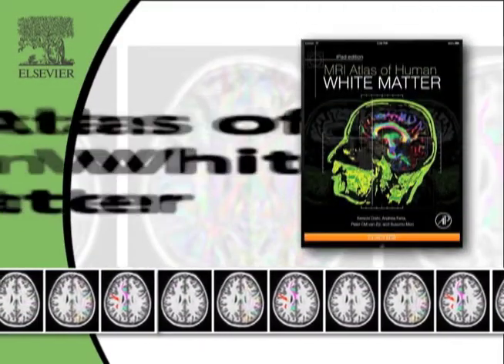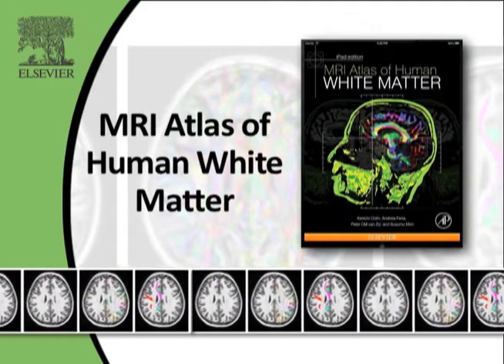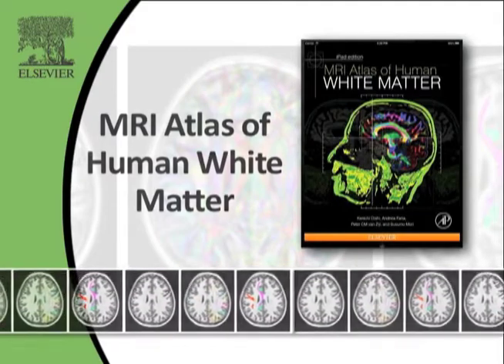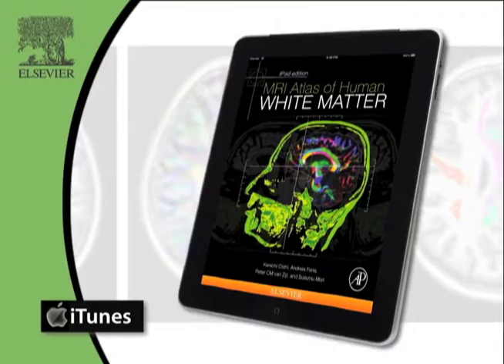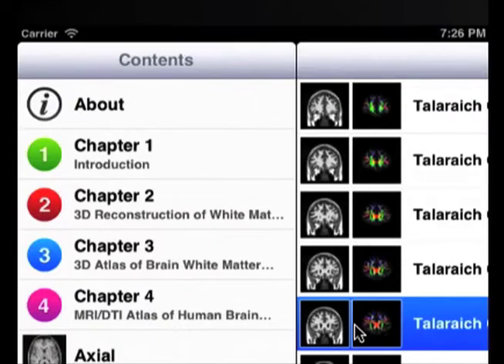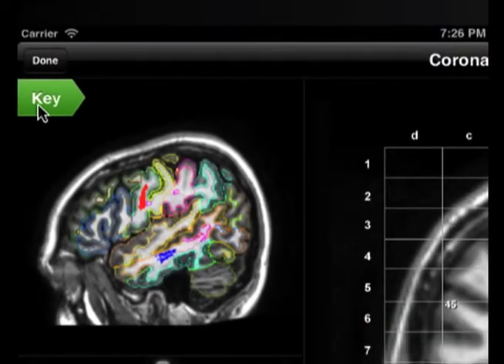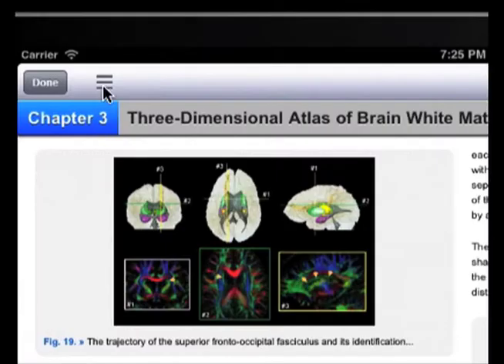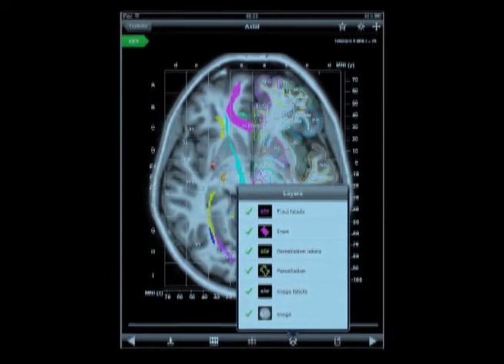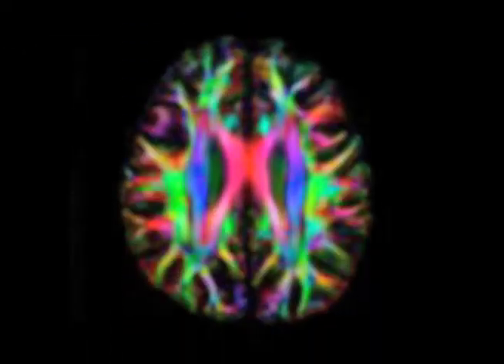Visualizing brain fiber tract or axon pathways has been made easier with Elsevier's new neural app, the MRI Atlas of Human White Matter. Ideal for neuroscience researchers and advanced students, this app was designed to assist in locating, visualizing, and identifying the major pathways through the brain and their proximity to key neuroanatomical structures.